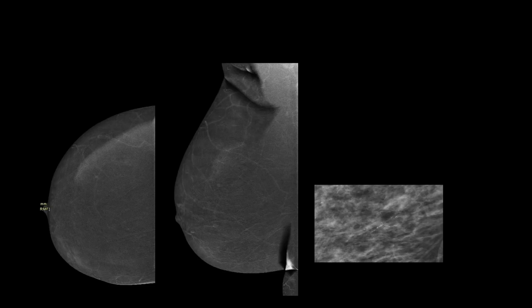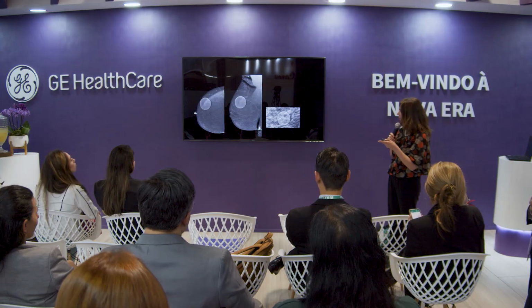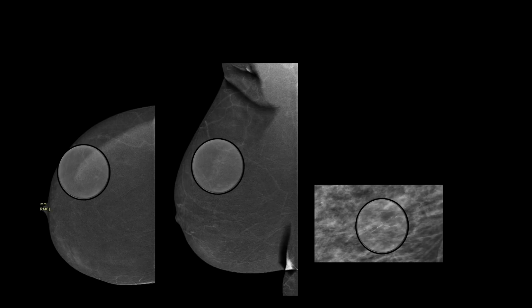This is another example. Again, enhancement, we know also with MRI, DCIS, you see the calcifications, pleomorphic, branching, suspicious. With MRI, it would be impossible to register the enhancement. Here, you can see there is minimal enhancement on this upper outer quadrant, non-mass enhancement. But we are not doing that to discover that. We're doing that to say that probably we're not missing any invasive cancer. So you can see that the patient has a dense breast. We know that this is not the tip of the iceberg. We don't need to worry about it. It's only DCIS. So we don't really care about this enhancement in reality.